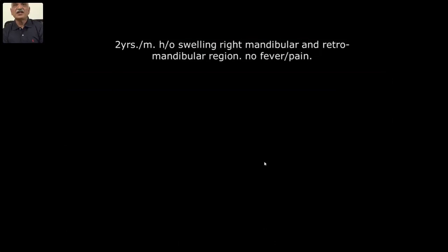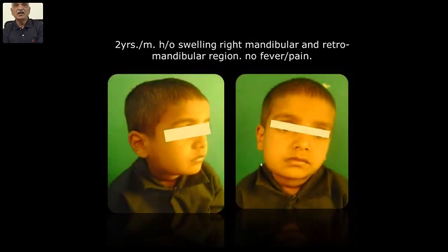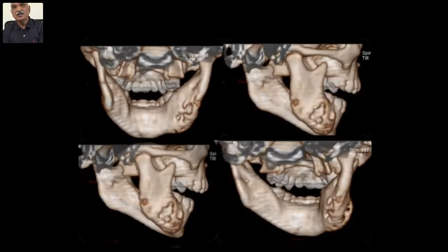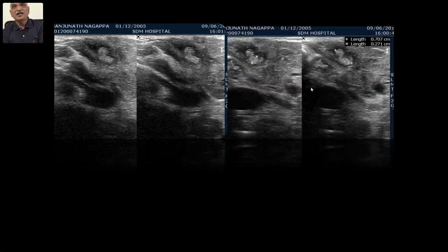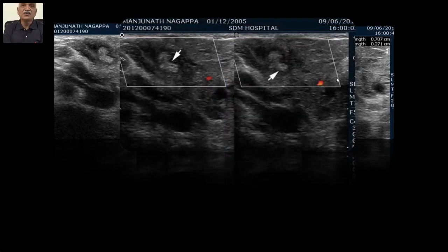Two-year-old male with history of swelling in the right mandible and retromandibular region — no fever, no pain. Initially they did an OPG and could see destroyed mandible, thinking it was osteomyelitis, but externally there were no draining sinuses. CT was done and associated with osteomyelitis, but none could give the cause. Interested in ultrasound, they referred for it. Surprisingly, I could see a well-defined hyperechoic cluster-related structure scattered within the lesion, surrounded by hypoechoic area — classical appearance of a fungal colony.